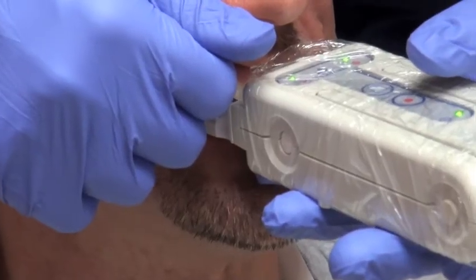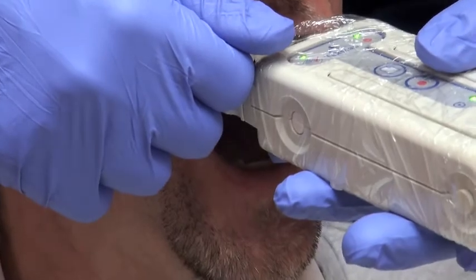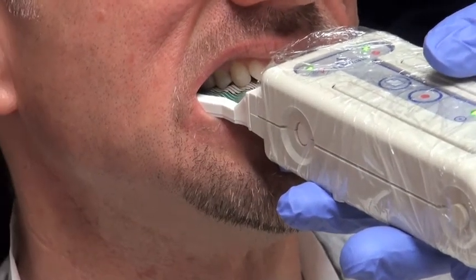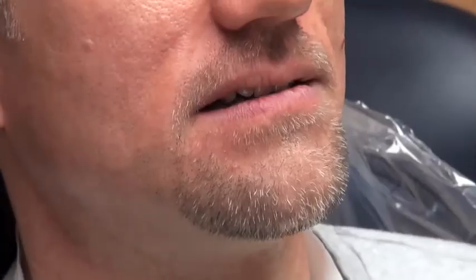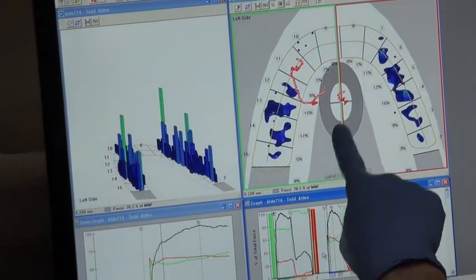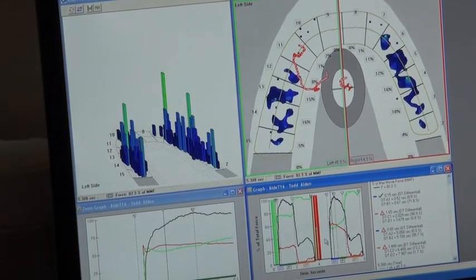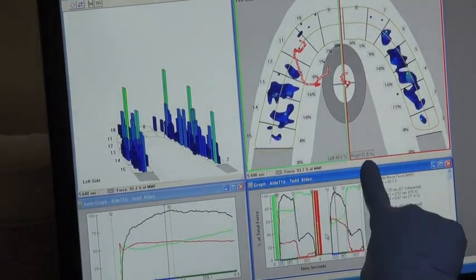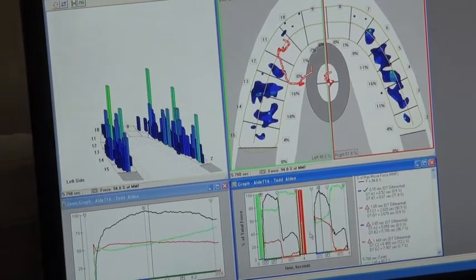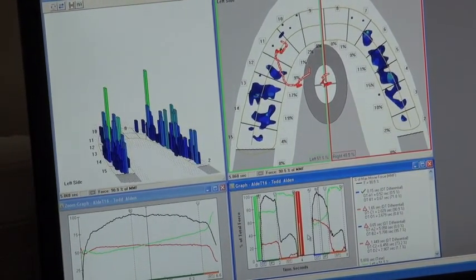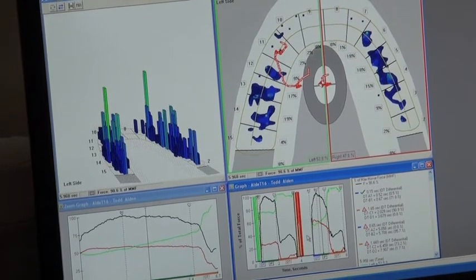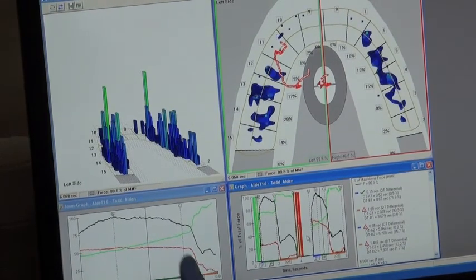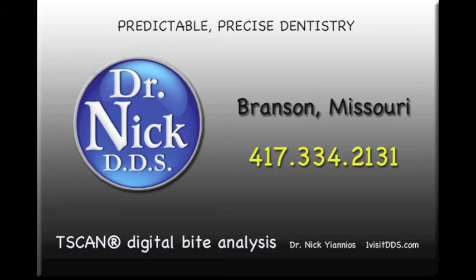A subsequent reading using the T-scan demonstrates this permanent change in the patient's bite, as the center of force kite is located right in the center of the graph on the right, indicating a much more even, stable, and healthier situation. The patient now has a balanced bite approaching a 50-50 right-to-left scenario, which eliminates many of the symptoms of an imbalanced bite. T-scan digital bite analysis allows the dentist to accurately quantify the patient's bite, ensuring a stable and asymptomatic occlusion. Welcome to the future of precise and predictable dentistry.